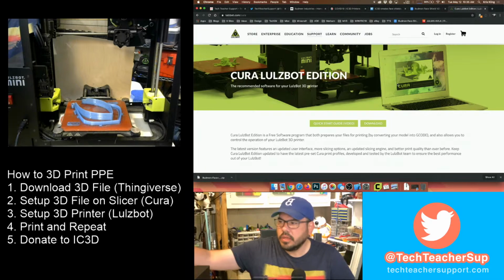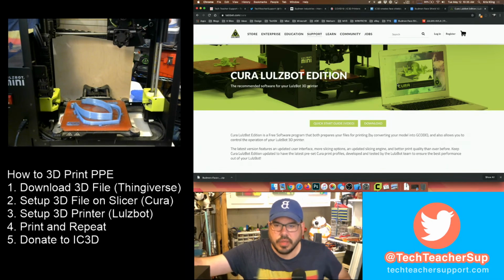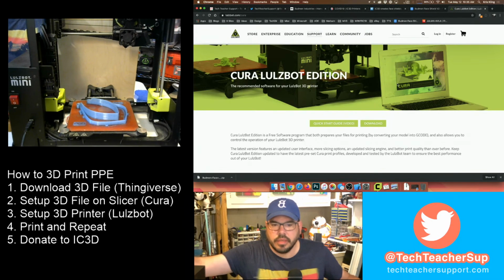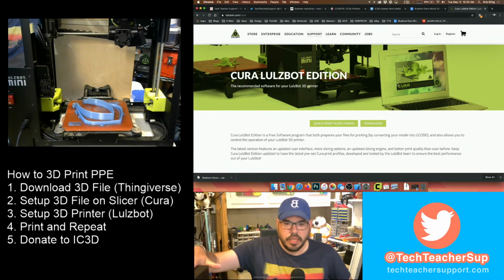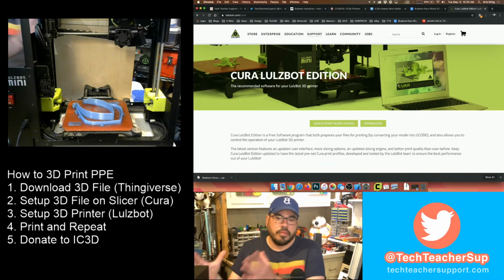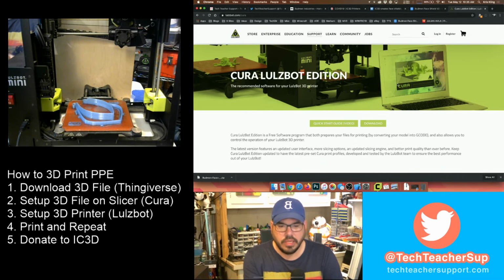We have what's called a Lulzbot Mini. I think you can kind of, let me move the camera here. Right here is our Lulzbot Mini. All right. And so it's ready to print right now. It just needs information sent to it. And so the way you do that is you use a slicer, and we're using Cura.